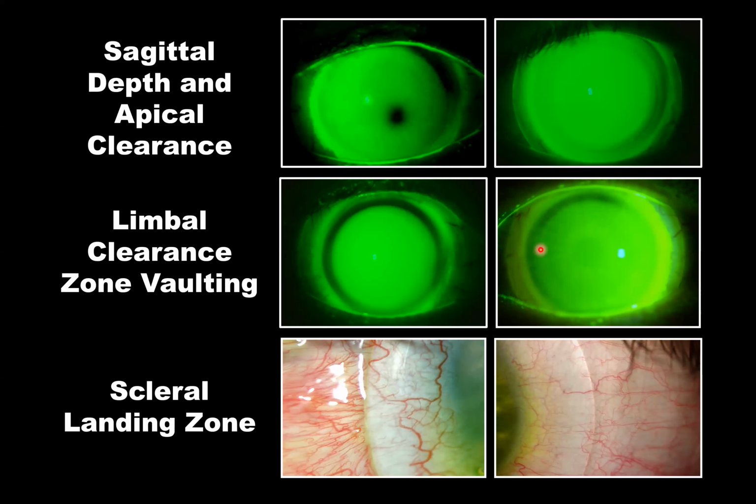See if there's any real bearing, because this may be false touch. This may be thinning of the fluid, but not true bearing. When you have 180 degrees or more of thinning, that's almost certainly corneal bearing, and that's going to disrupt the epithelial surface that needs to be adjusted.